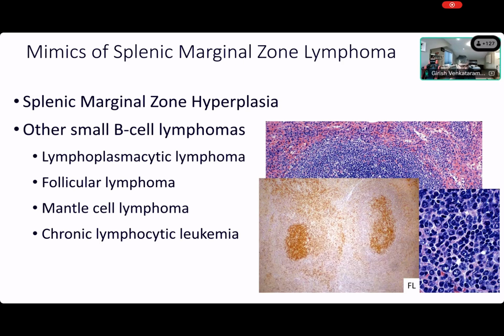Hopefully you will have CD10 and BCL2 if it's a low-grade follicular lymphoma. If it's a high-grade follicular lymphoma, your CD10 might be negative, your BCL2 might be negative, and then again you'll be stuck, right? Then you have to get back to your morphology of nodal lymphoma.